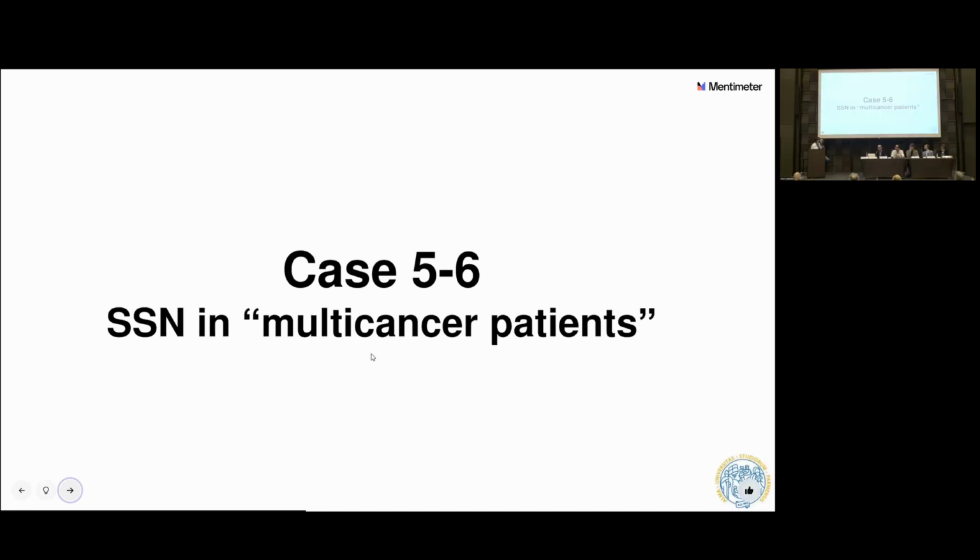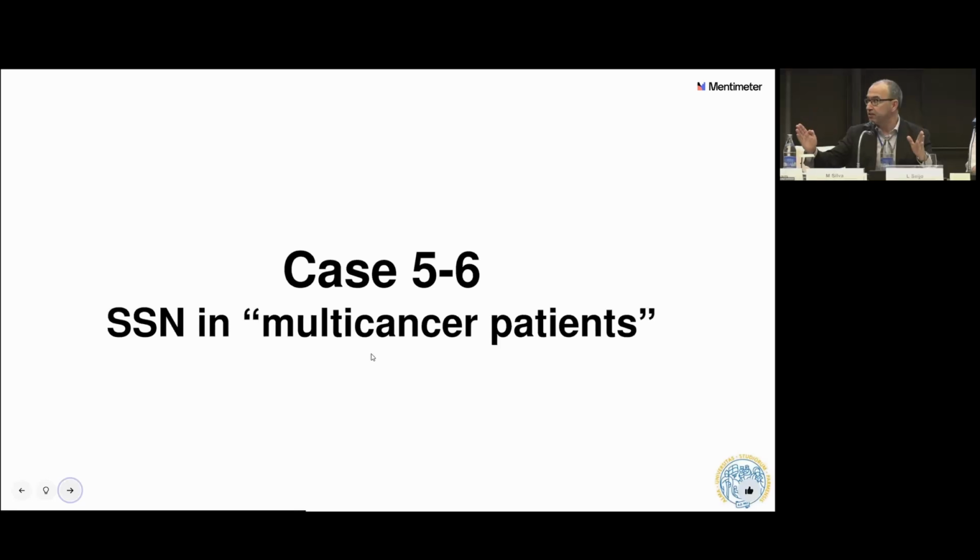Yes. We have this tendency to think that, when you have that much distance between the first and the last scan, it's clearly not the same lesion as time goes by. And so you don't really know when it started growing, right? Because you had a 10-year difference. So there's a bias there, thinking that its doubling time has to do with the first and the last scan, but this might have changed. Maybe it was a pre-malignant lesion 10 years ago, and it became malignant 6 months ago, in the sense that it started growing very quickly.